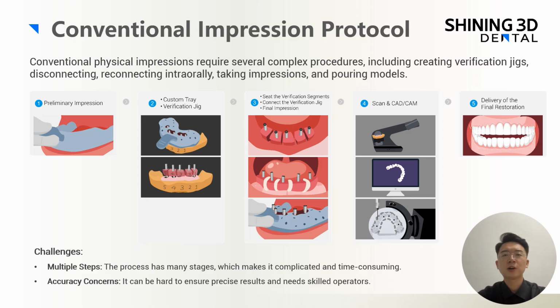Traditional impressions are complex to perform, impression materials will deform, and it will cause an uncomfortable experience for the patient as well, especially due to the high reliance of the traditional workflow on operator skills and experience.